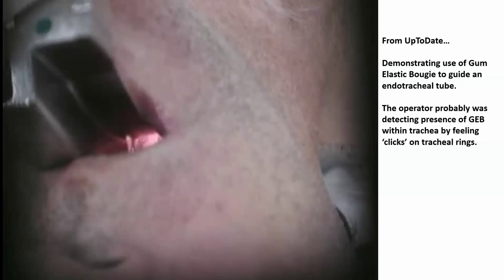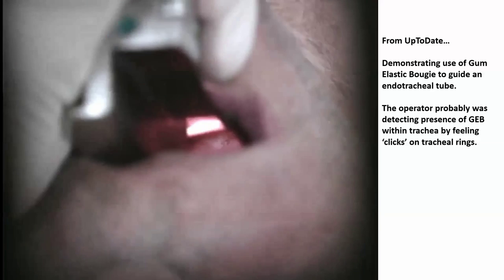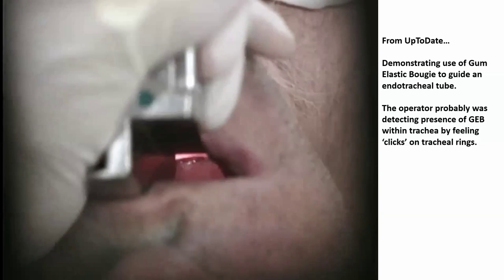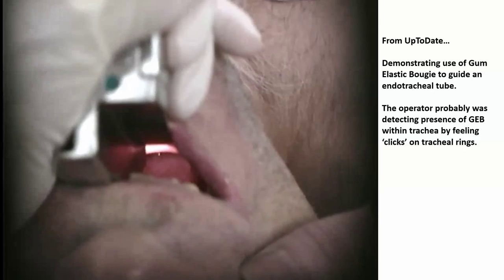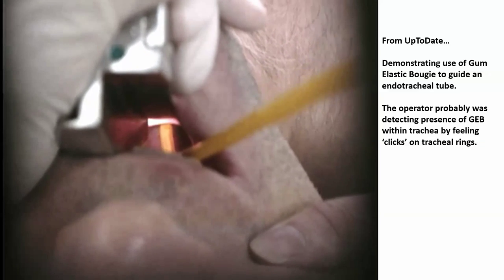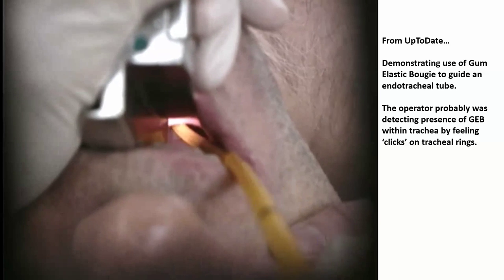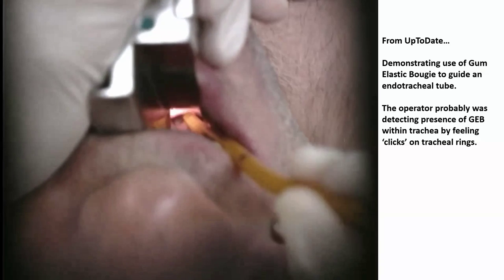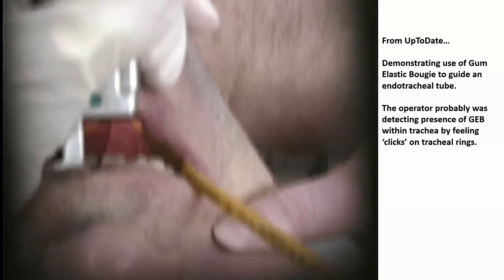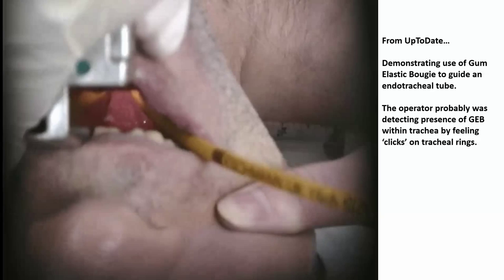And one of the things which is typical of the gum elastic bougie is the sensation of the tracheal rings. As that bougie is advanced into the trachea, you can feel the tracheal rings, and that's a pretty good indication that you are inside the trachea.